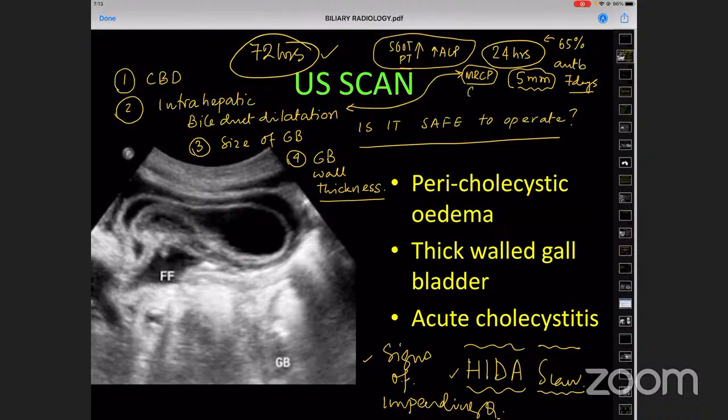Do you think MRCP versus a CT? Because we surgeons have a feeling that MRI is not that good with fluids, and acute cholecystitis is all about inflammation and fluids. At this point, do you think that CT is better than an MRCP? My practice is to do a CT rather than an MR, hence the reason for asking. I will ask Avik, because with modern generation machines, I think fluid is probably better shown on a T2 weighted image with an MRI rather than with a CT. But I'm willing to learn from Avik.